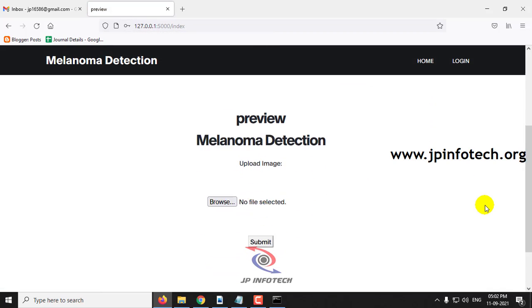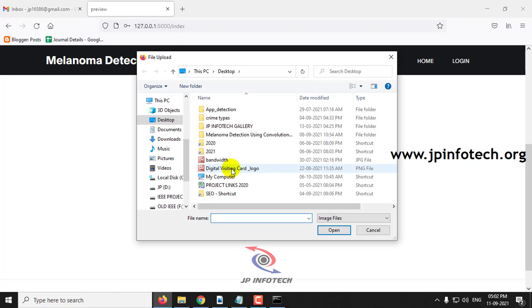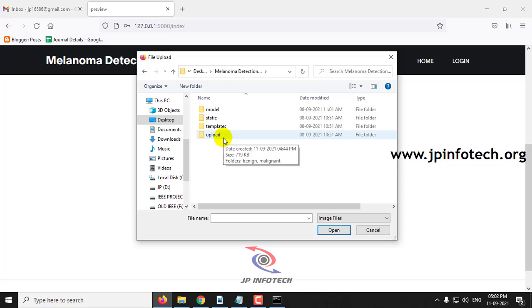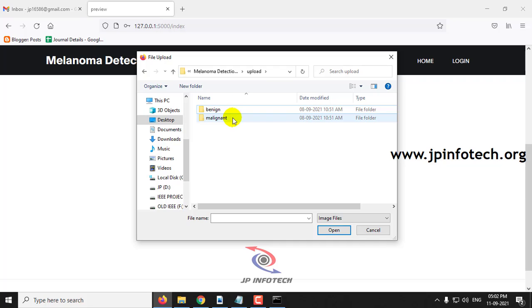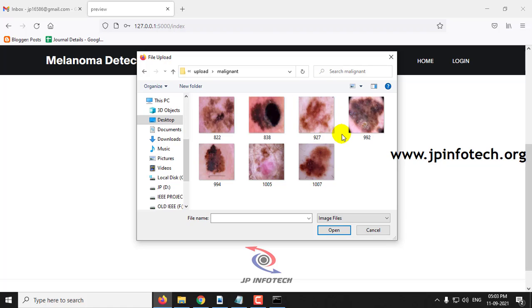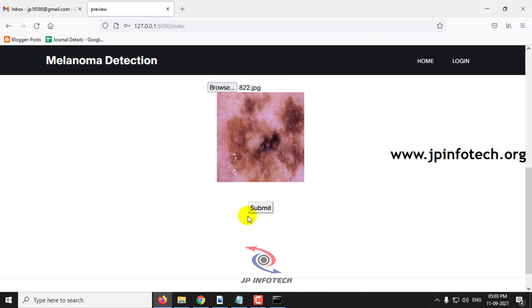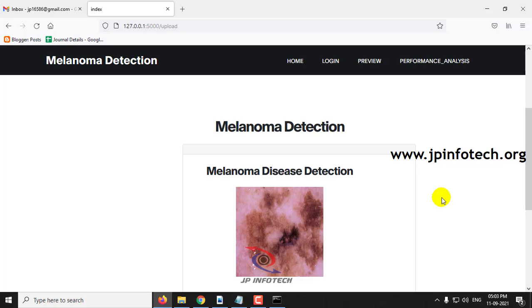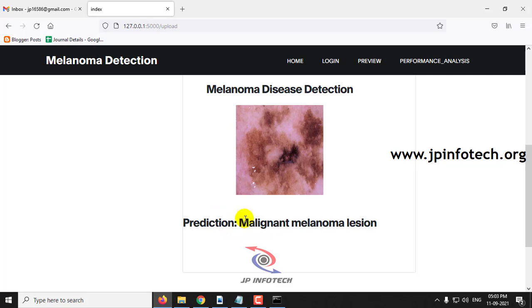Once the login is successful, it will navigate to the preview part where you need to upload an image and check the melanoma detection. Go to the source code location where you can see the upload folder with two categories: Benign and Malignant. Let me go to the Malignant folder, select an image, and click submit. You can see the melanoma disease detection prediction result, which detects it as Malignant melanoma lesion.